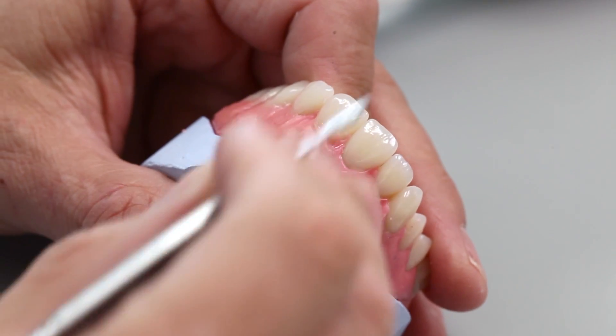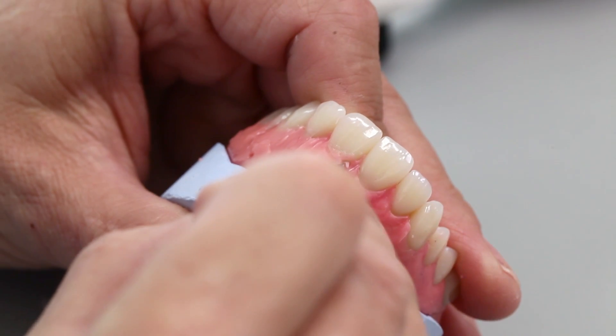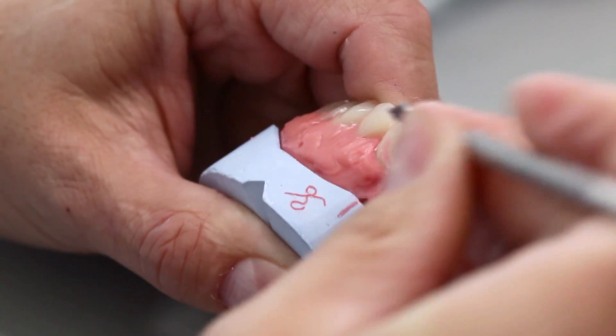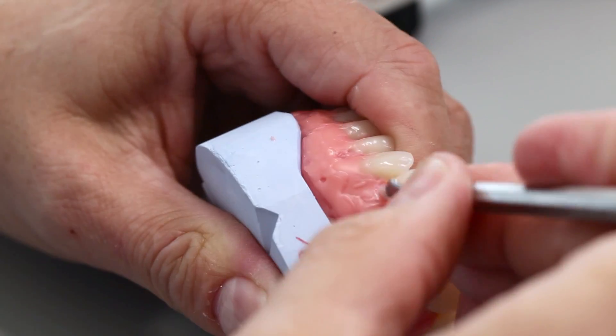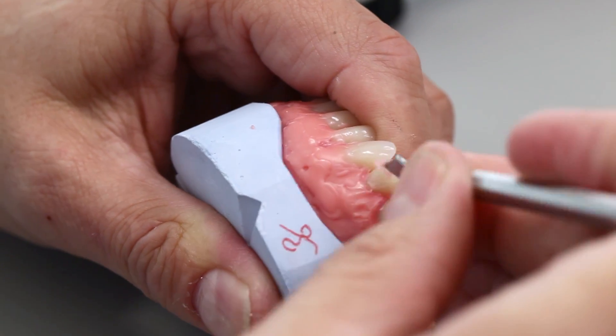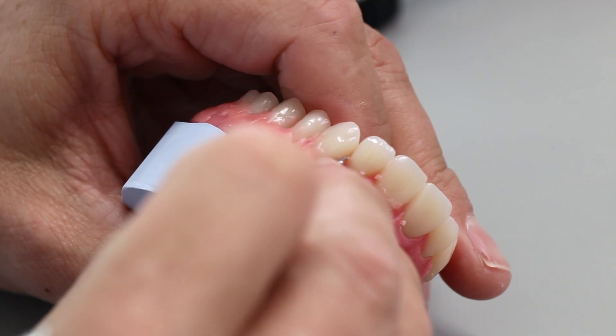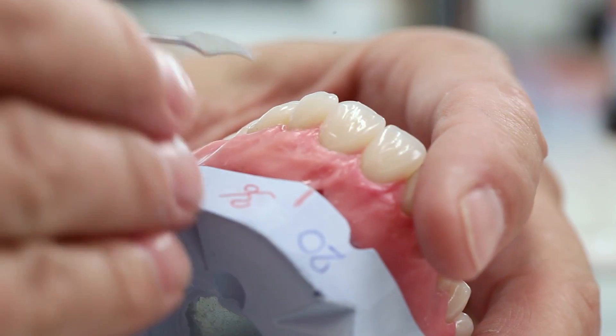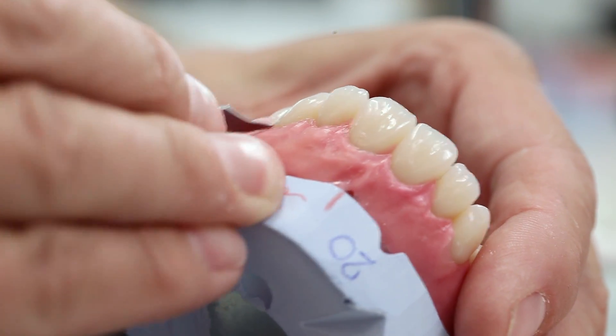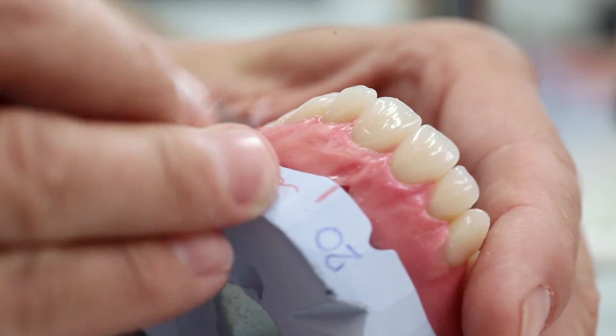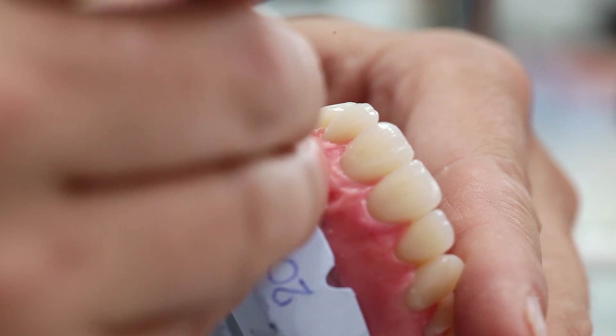The following important points have to be considered in this context. Basically, contour the gingiva in such a way that it's easy to clean and has a life-like appearance. Two prominent contours such as balconies must be avoided. In the maxillary anterior region, the gingival margin tends to run the highest in the distal third. In contrast, the lowest point in the mandible tends to be in the centre area.